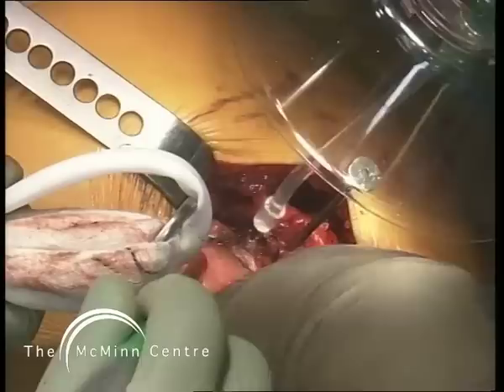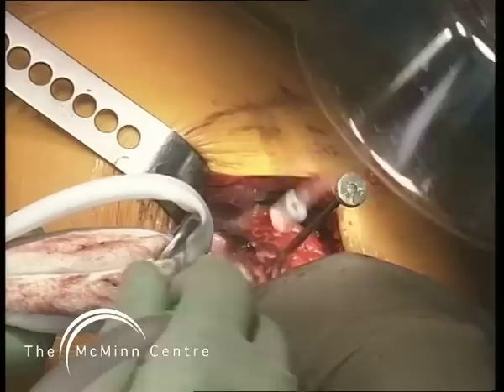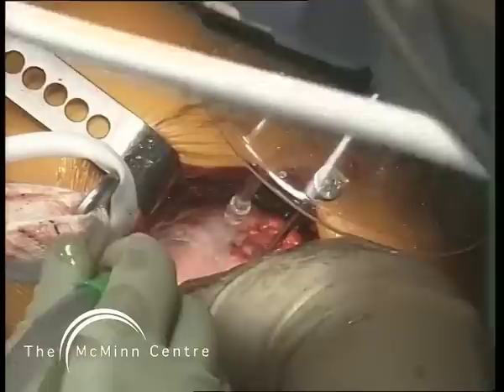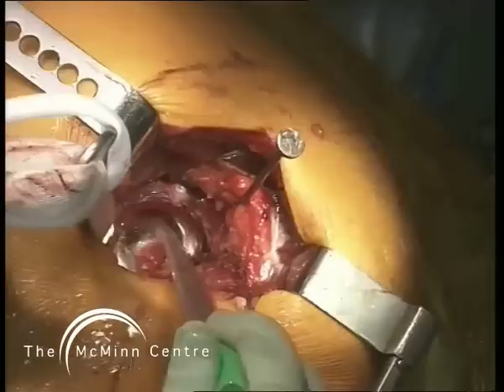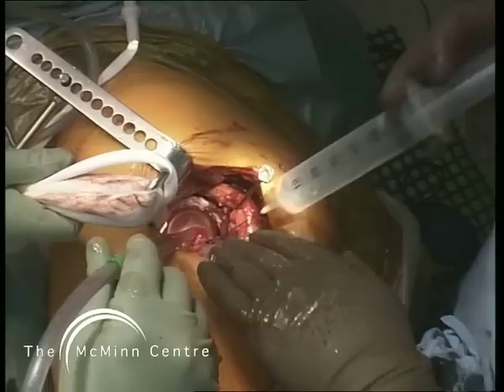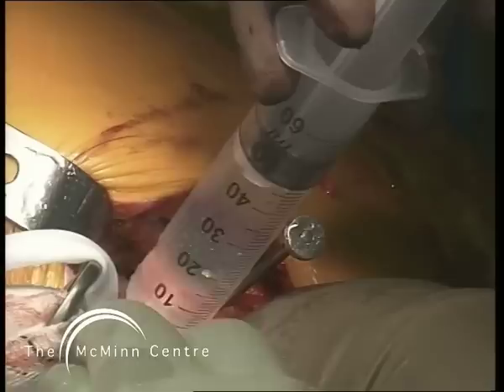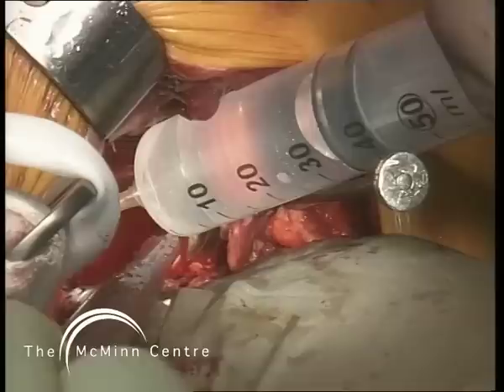I like to irrigate the wound, clear out all debris, and also keep the rest of the wound moist. We then insert local anesthetic and adrenaline. The regime I use is from Sydney, worked out by Drs Kerr and Kohan. We insert 3 lots of ropivacaine and adrenaline. The first lot of local is inserted after acetabular component insertion, spaced apart during the procedure because we do not want high levels of ropivacaine getting into the bloodstream.